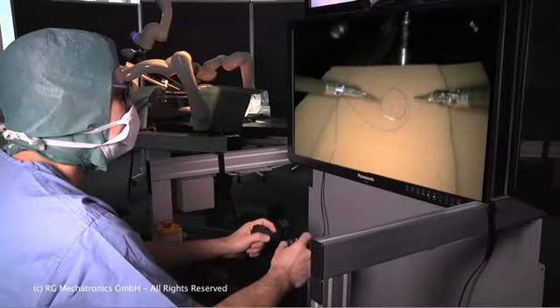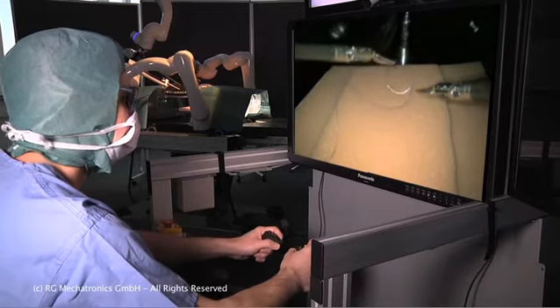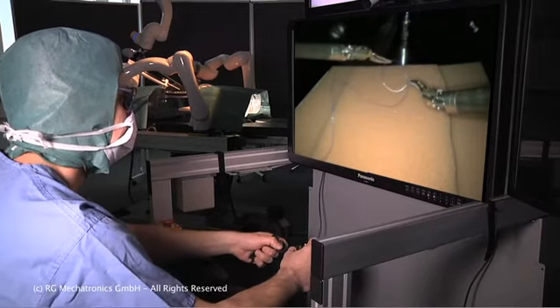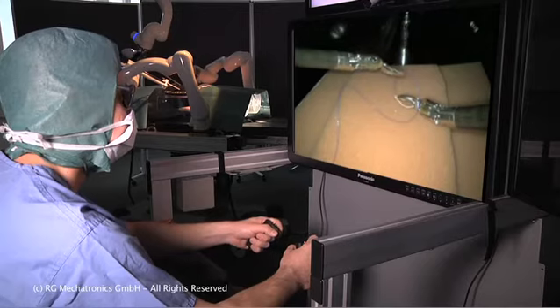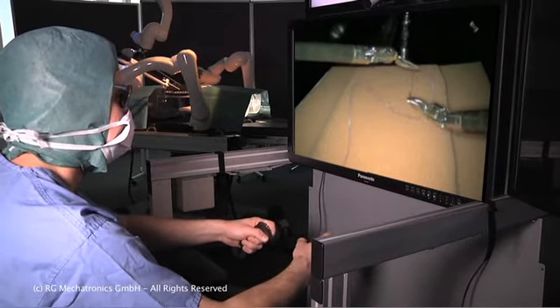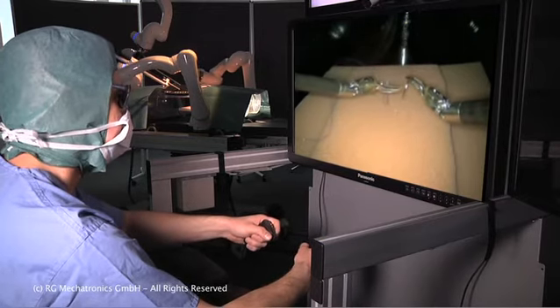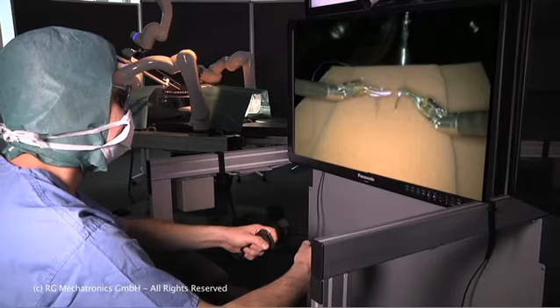The surgeon sits at the console and is free to move his hands as and where he likes. If necessary, it is possible to declutch the instruments and move the hand to a completely new position. In this case, a simple demonstration of suturing is being performed.